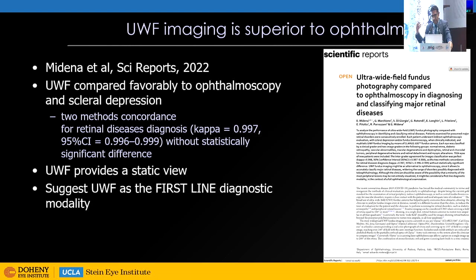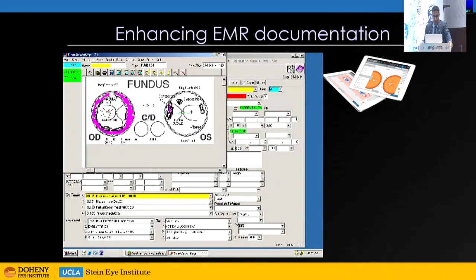I think it's very helpful with dynamic indentation ophthalmoscopy to try to see vitreous traction. This is where I very much agree with Dr. Vatsal that having peripheral OCT actually does get us to that point now, because not only do you get the entire image, you can actually study those areas to see if there's traction. And so I would tend to agree with the conclusions of this paper now, as I'll highlight.